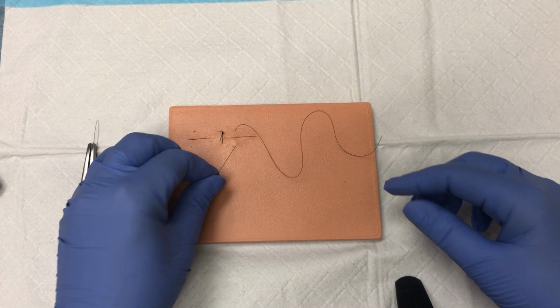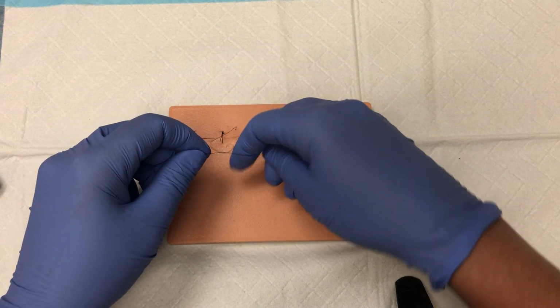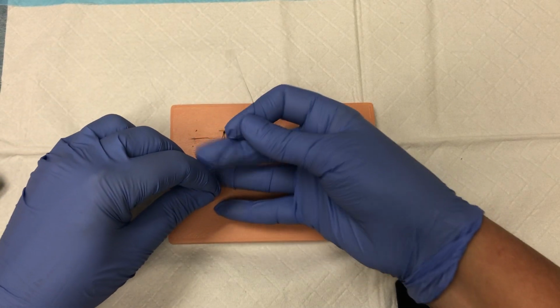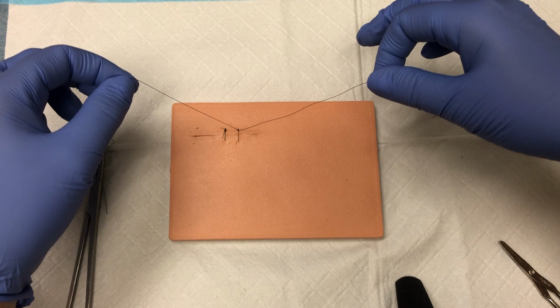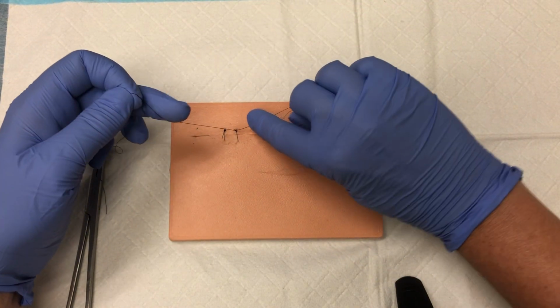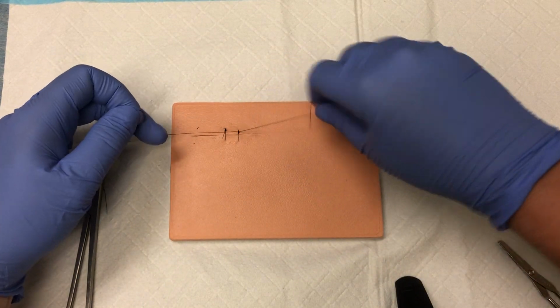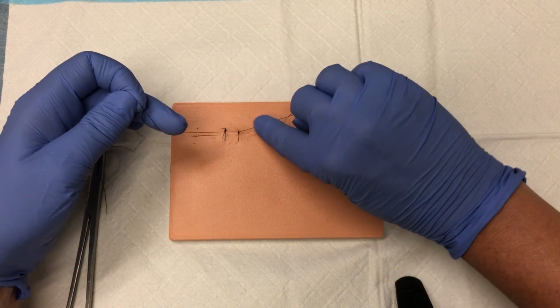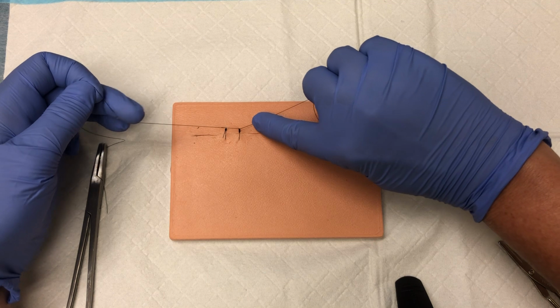That's trying to help restrict the potential for injuring those around you. So I'm doing a one-handed tie. I'm doing it right-handed. My left hand is basically just keeping the needle driver down on the patient, down on the field, so that nothing is moving.